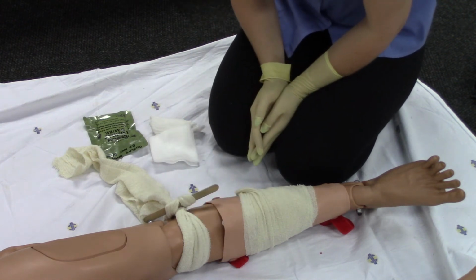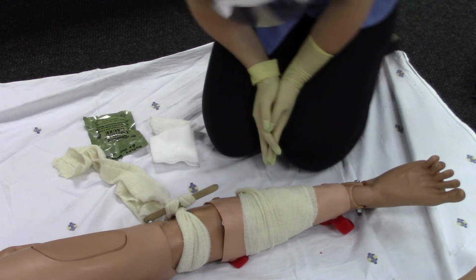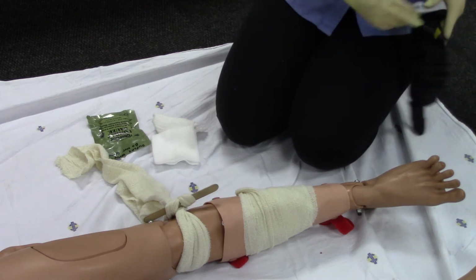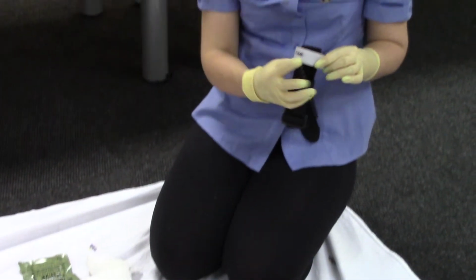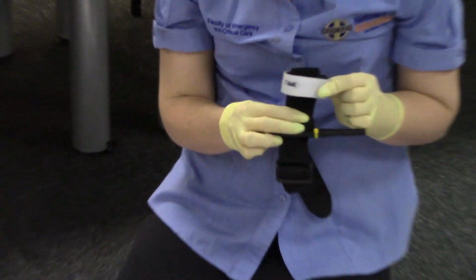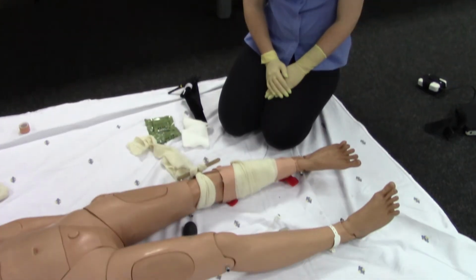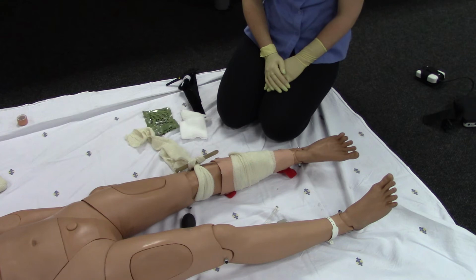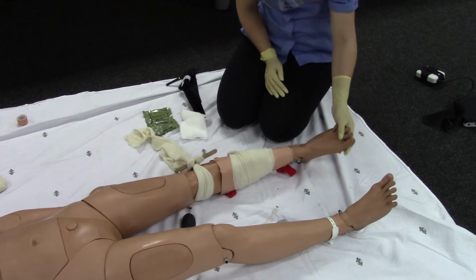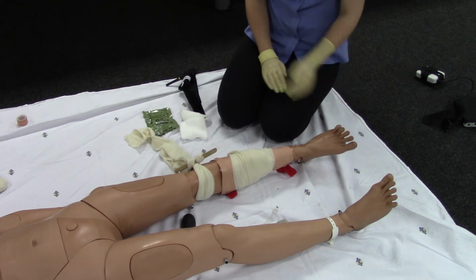Step 6. Limb assessment and documentation after tourniquet application. Record the exact time, hour and minute, that the tourniquet was applied on pieces of adhesive tape placed on the tourniquet. Inform the receiving facility or crew handing over to about the tourniquet, and periodically assess the limb where the tourniquet was applied for pulse, motor and sensory function. So can you feel this?